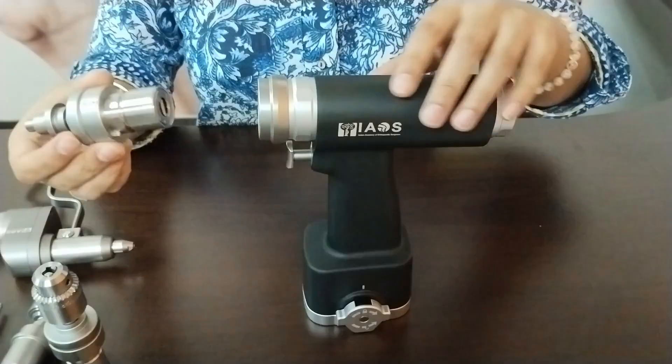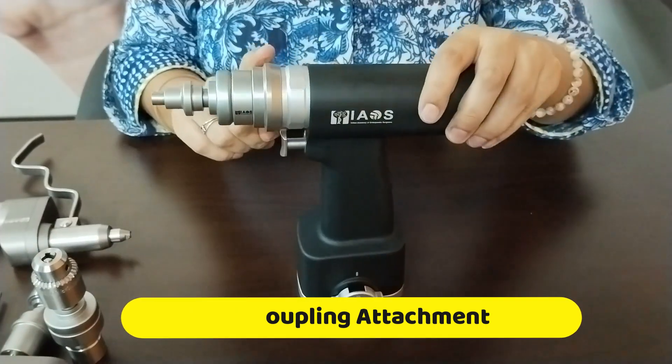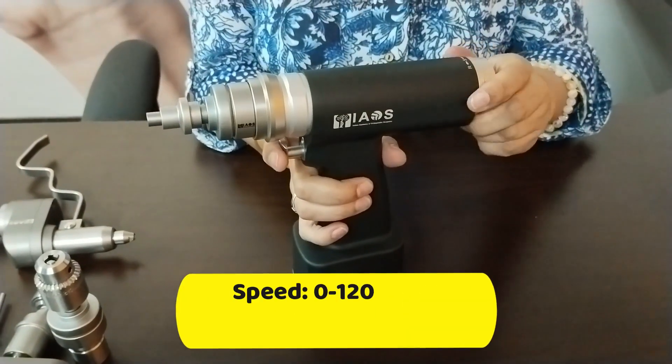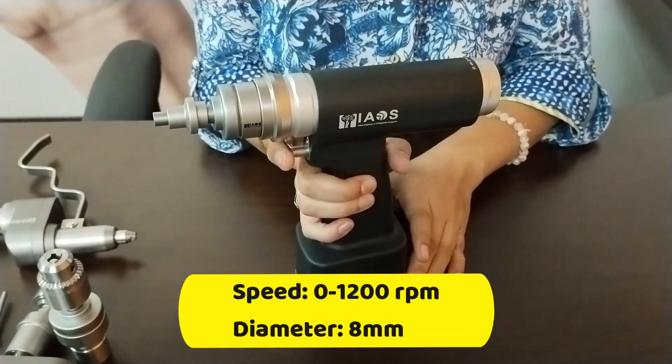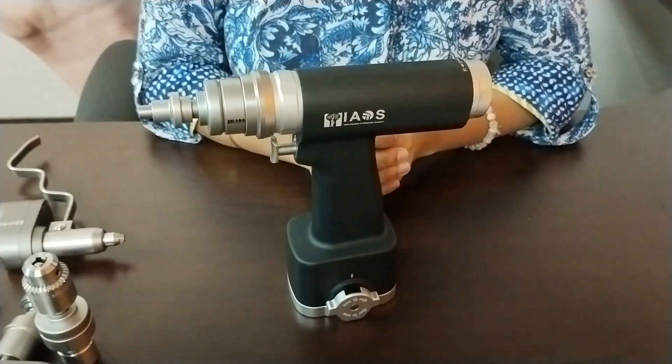Next is the quick coupling attachment. It closes with a snap. The technical specifications for this are 0 to 1200 RPM with a diameter of 8 mm. This is also suitable for trauma surgeries.